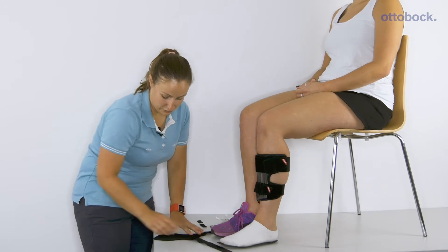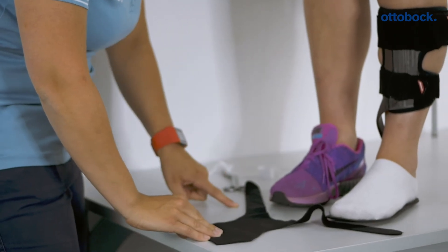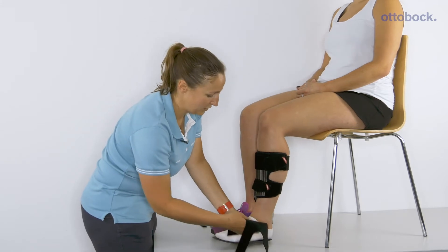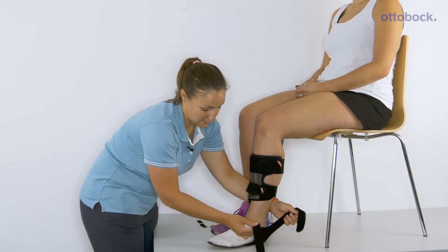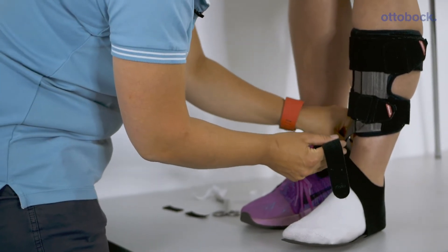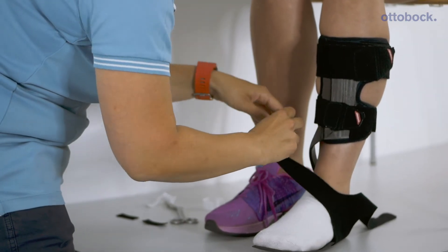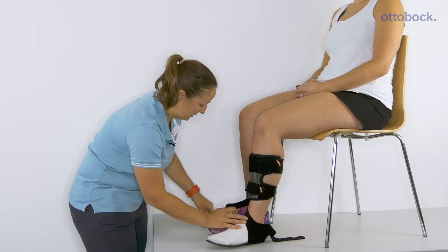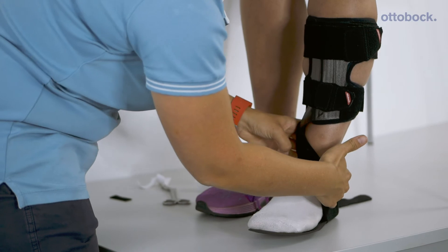With the supination strap, the square edge is going towards the toes and the rounded edge is going towards the heel. Initially, lift the foot and attach the strap underneath. Then use the hammock-shaped section to come up and around the malleoli to get some control. With the anterior strap, go over the dorsum of the foot, bring it around the back of the medial strut, and then use one of your doubled-over pieces of velcro to attach it back and hold it in place.